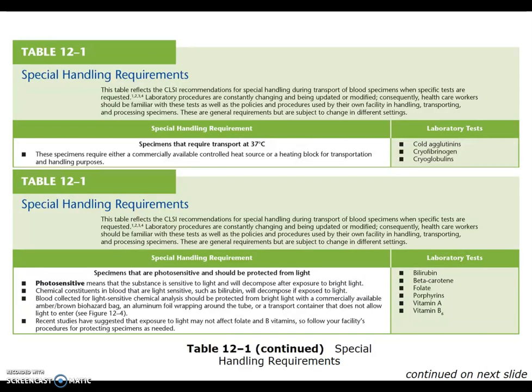Recent studies have suggested that exposure to light may not affect folate and B vitamins, so some facilities don't have this in place, but definitely the bilirubins, we draw these for infants that have a jaundice-like appearance when they're born.